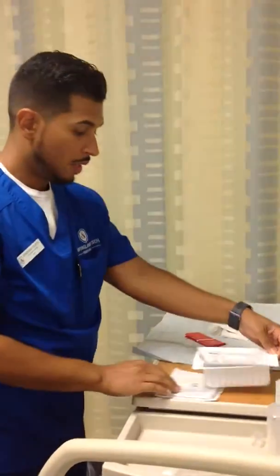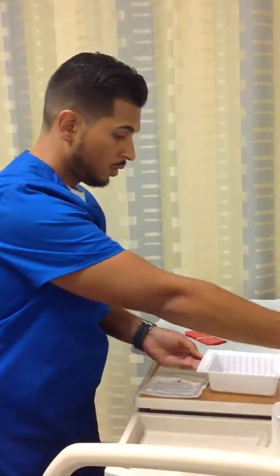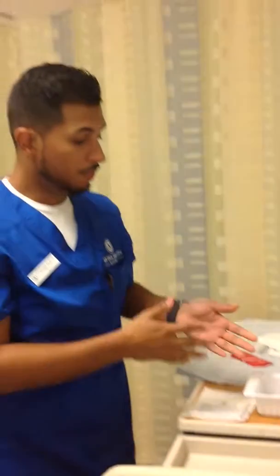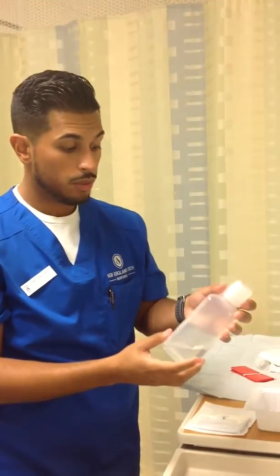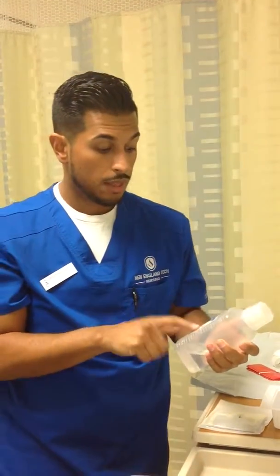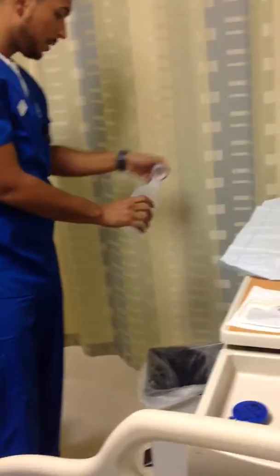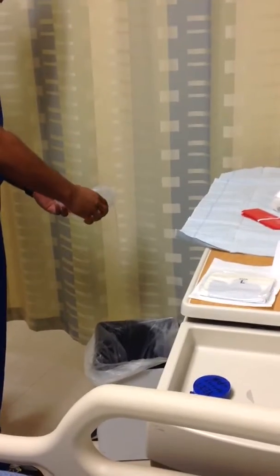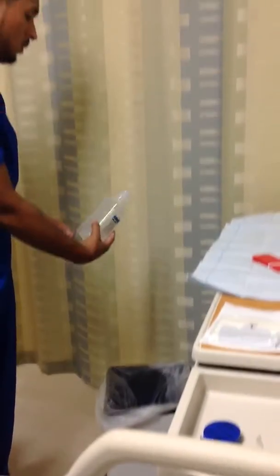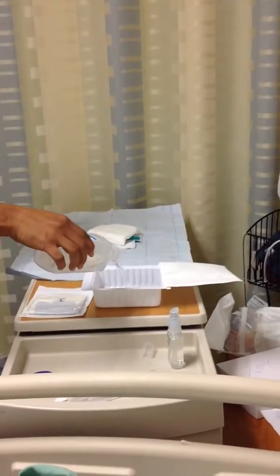I then want to pour saline into my tray. This saline, as you can see, has already been used. I would want to check for the time and date that this saline was last used. I also want to lip it. Alright, and then I can pour the saline, making sure not to touch any of the edges of the tray.